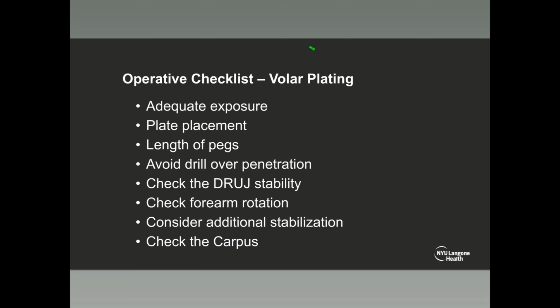If you're using pegs or screws, you want to be very cautious about the length of those. If you're too long dorsally, then you'll cause irritation to the extensor tendons. Avoid drill over-penetration for the same exact reason. The extensor tendons are stuck down right to the bone. You don't want to drill right through the tendons.